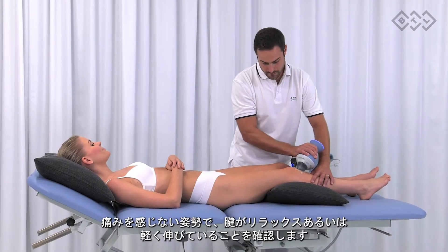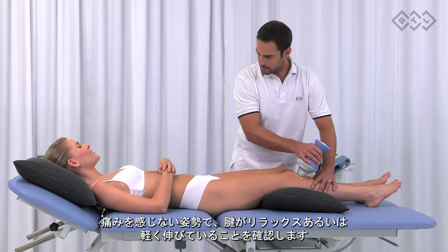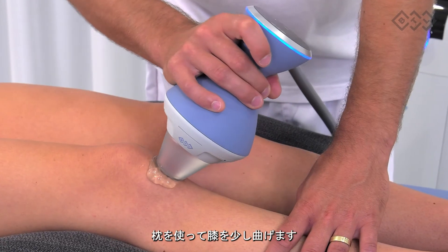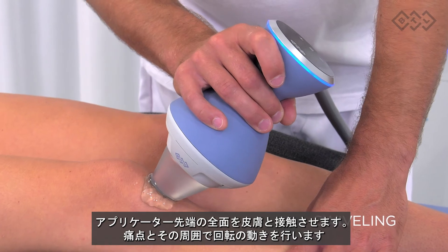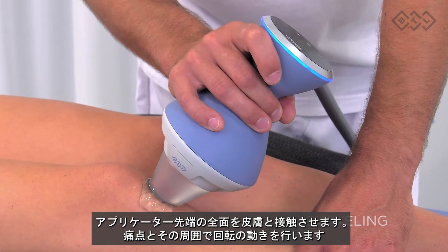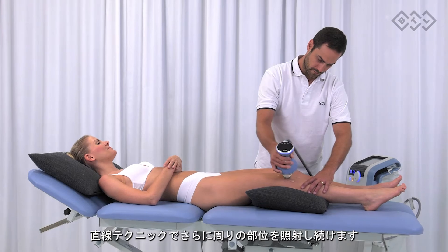Patellar tendinopathy. The tendon can be in a relaxed position or gently stretched but not in a painful position. Use the pillow to slightly bend the knees. Apply full contact therapy and perform swiveling movements in the most painful spot and its proximity. You can continue with the painting technique to treat the surrounding area.